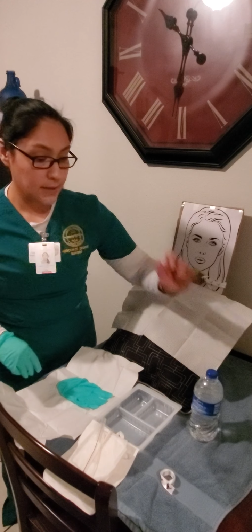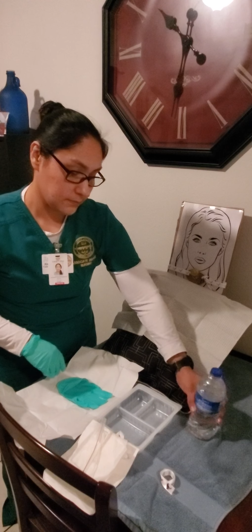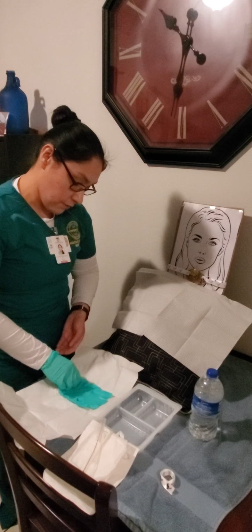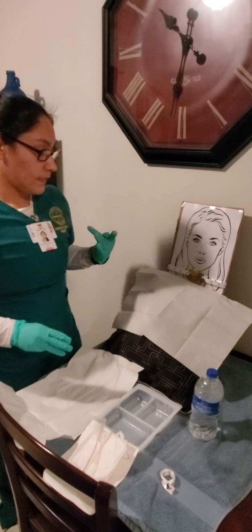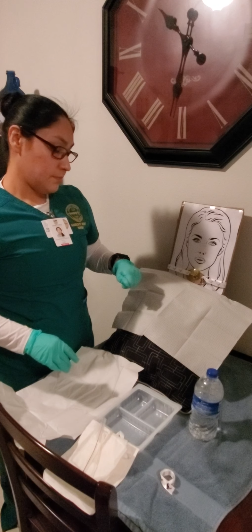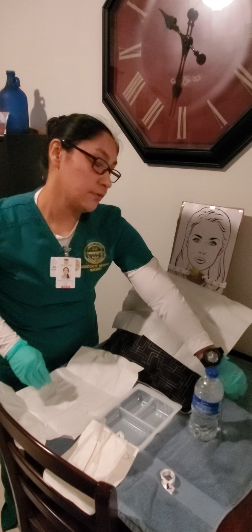With my non-dominant hand, I'm going to go ahead and open the saline and pour it into the 3 trays. After doing that, I can now don a sterile glove on my non-dominant hand. The first thing that I'm going to do is remove the patient's oxygen source and place it near the patient.